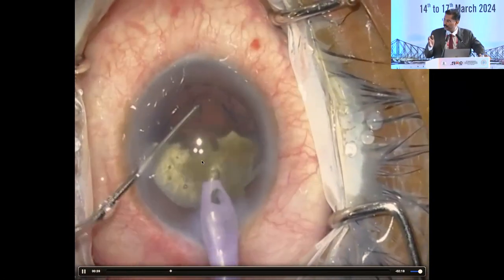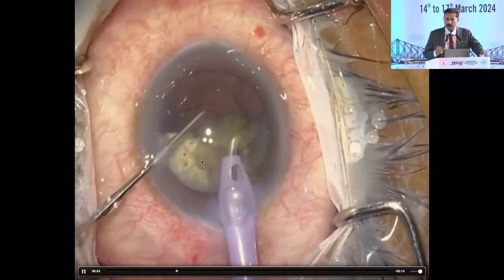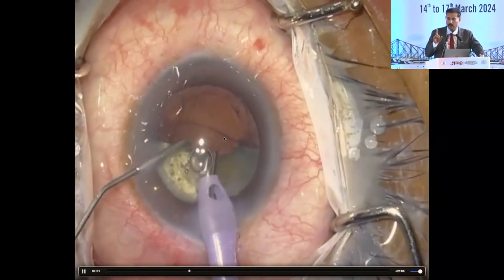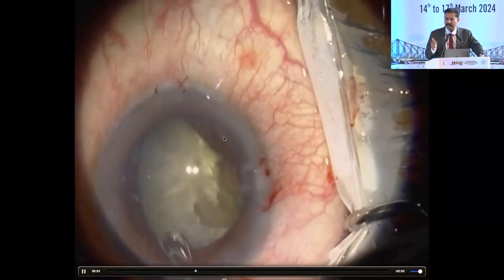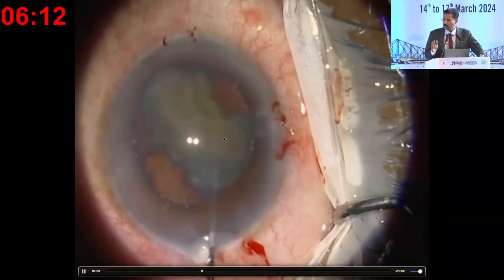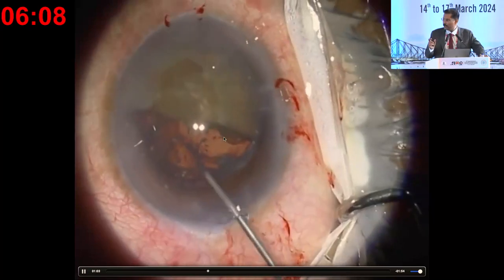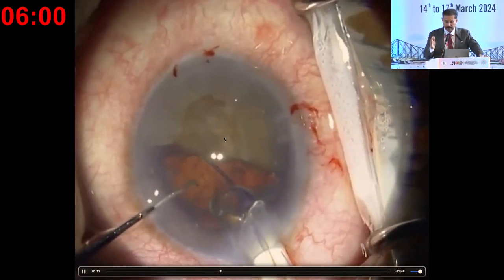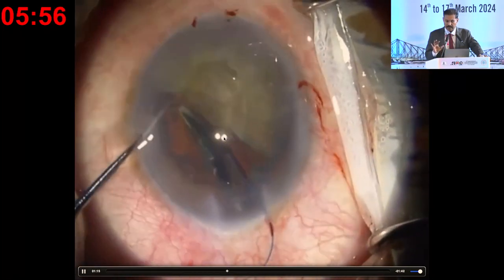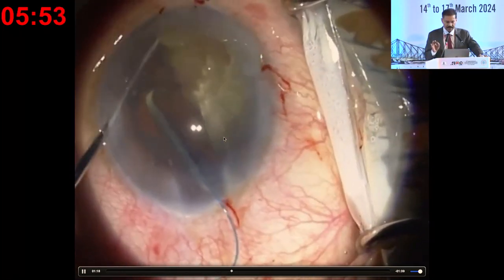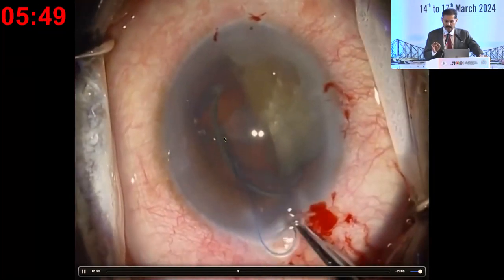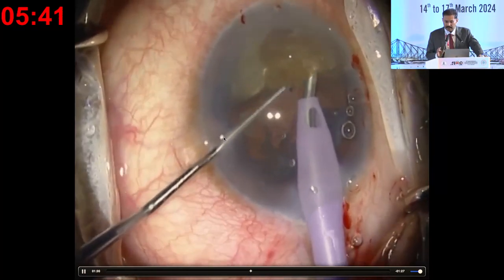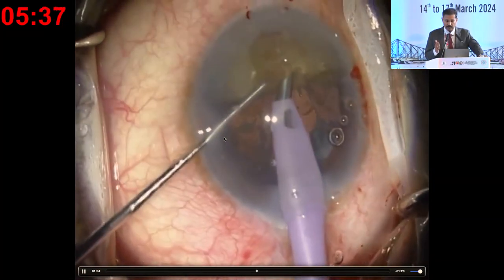Do most of the FACO without multiple sub-chops, because if you sub-chop into very small pieces, they tend to float around and drop through large posterior capsule openings. So I eat up the whole piece gradually and slowly. Now comes up the central opening — posterior polar cataracts which may hide behind mature cataracts like this, especially in India. This kind of linear line extending from one end to the other is mostly a posterior polar cataract which would give way with initial chopping. So now I bring out half of the nucleus into the anterior chamber and get a three-piece IOL. You can put it on top of the iris if you are not sure of the anterior rhexis margin, or if the rhexis margin is intact, you can place it into the sulcus itself.